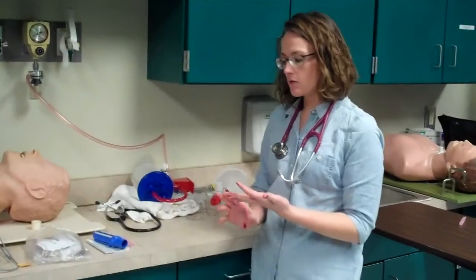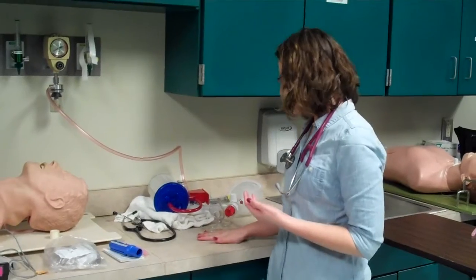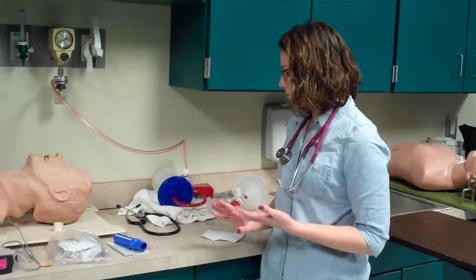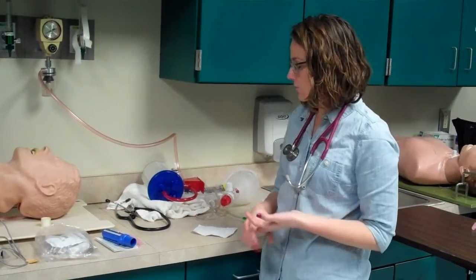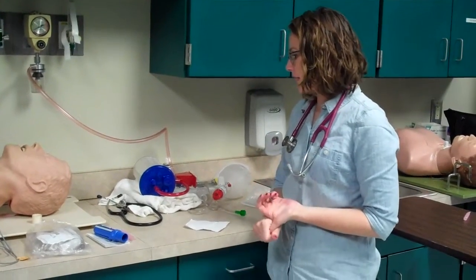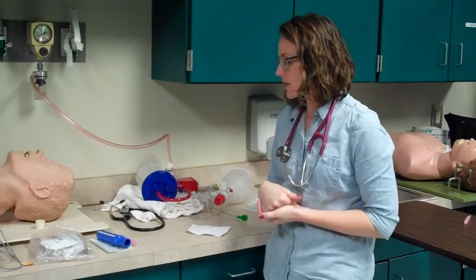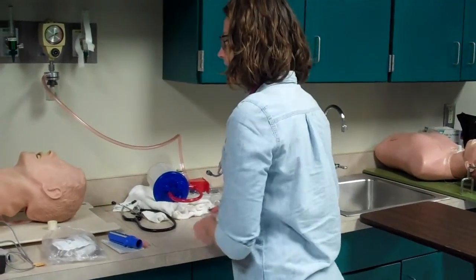And my requisition, and I'm going to go down. I'm going to check the patient's chart. I want first date, medical record, and patient's name. I want to make sure that the physician's order is in the chart as well. I want to see if they're allergic to any medications, if they've had the medication before, why they're here. Want to check x-rays, any significant findings, see if there's anything I need to know as far as this treatment goes.